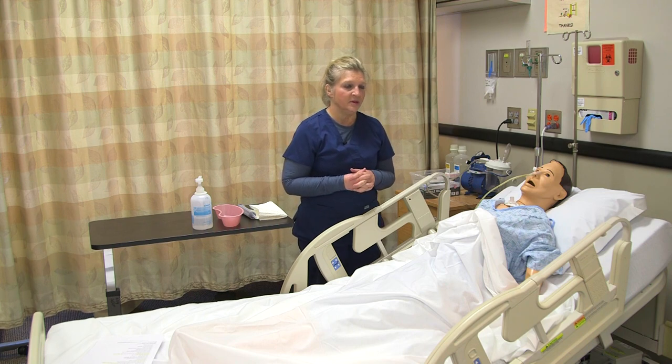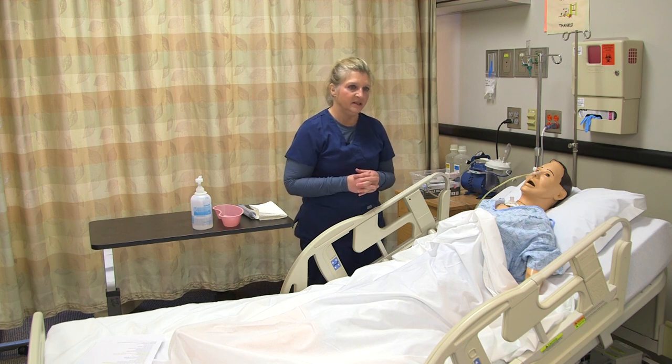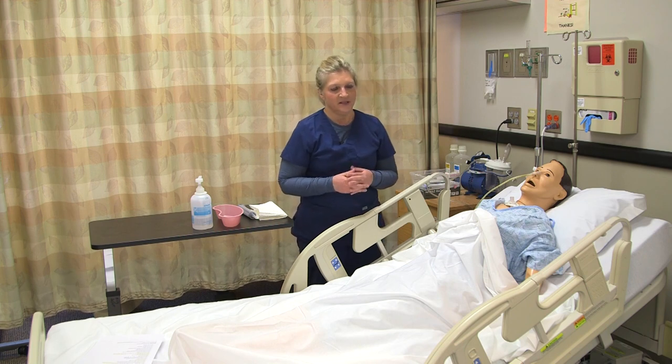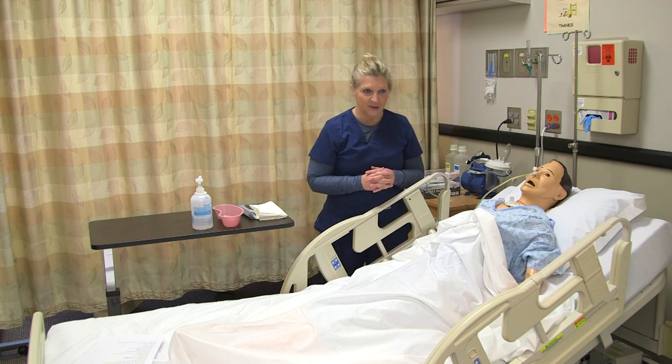Once in the room, I'm going to explain to my patient what I'm going to be doing. I'm going to tell the patient that I'm going to be removing the NG tube, and I'm also going to tell the patient that this usually is a lot easier than going in, so hopefully your patient will be happy about that.